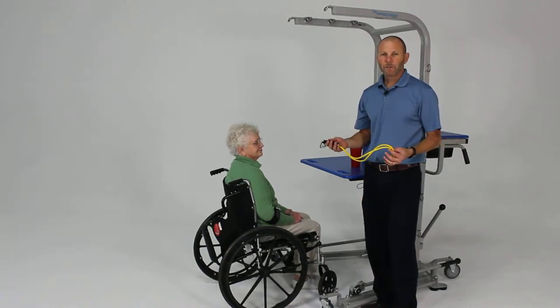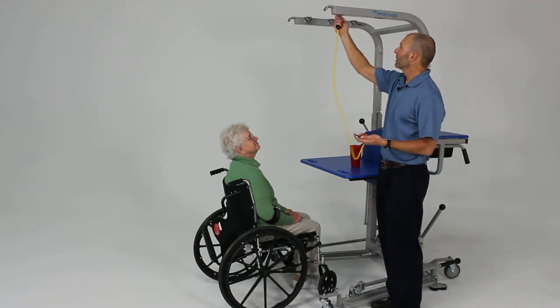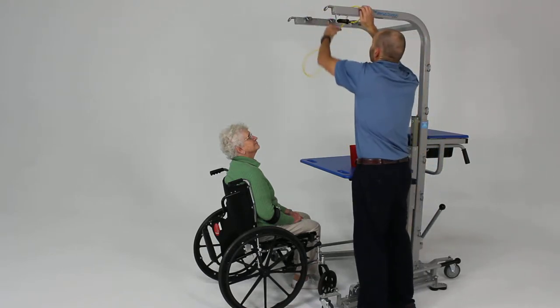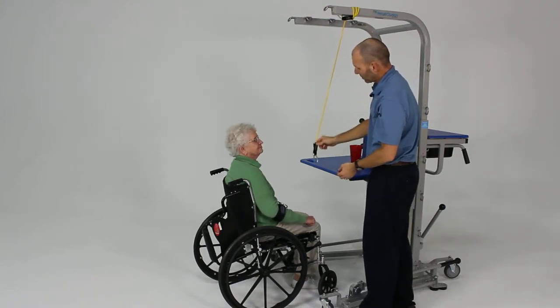Another way we can provide assistance to the upper extremity is just using the elastic bands. In this case we're going to take a yellow band and we're going to clip it to one of the upper support pieces and we're going to loop it over a few times just to take up some of the slack, to provide the amount of assistance we need, and get a sense for how much support we're going to give.